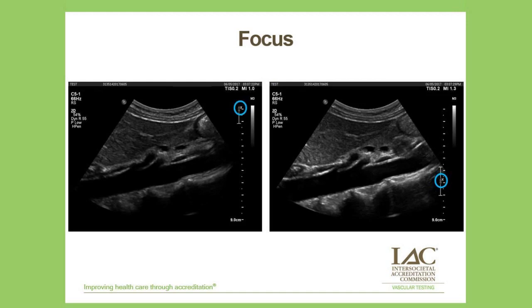When you're looking at the aorta, as in this picture, you want to put the focus right at the area of interest, and you get a better resolution throughout the image. And again, on the image on the left, you see what you need to see, but the one on the right just gives a better image. You have your focus where it should be, and it's all about optimization.